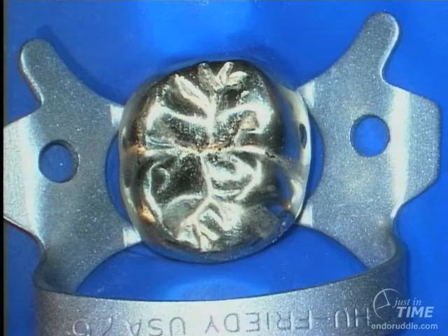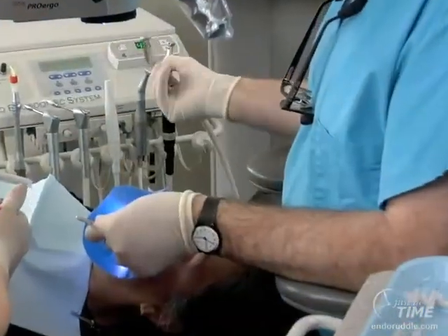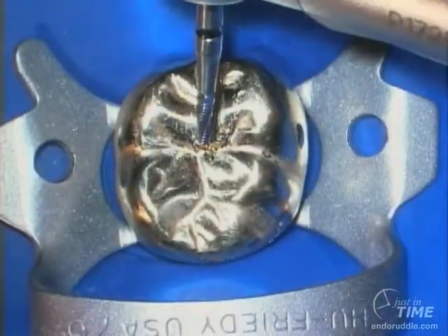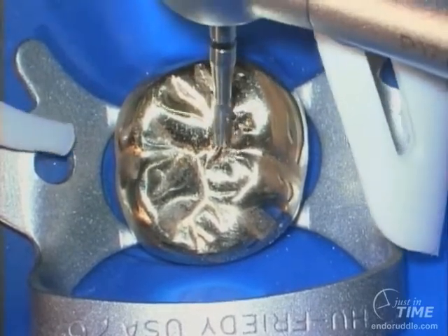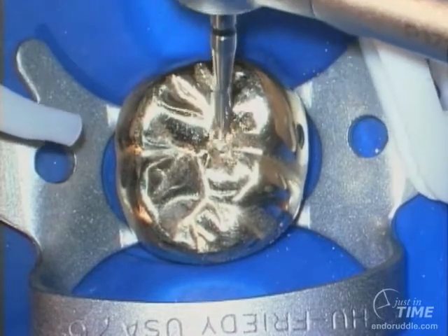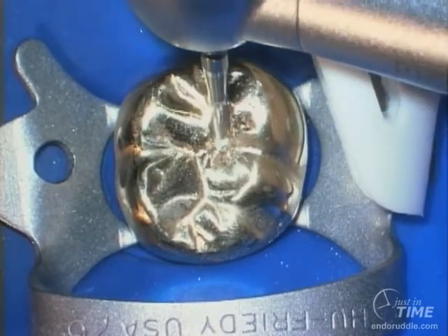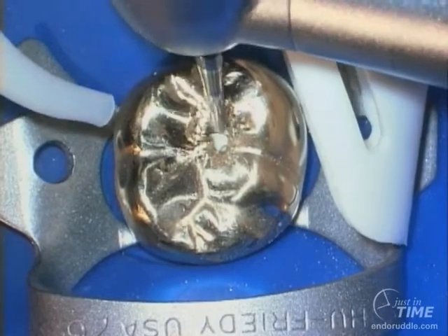Once we have sufficiently isolated the tooth to be treated endodontically, we're ready to begin to envision our access outline pattern. There's an old expression: start with the end in mind. I like to use the transmetal burr — it will reduce a lot of unwanted vibration. Lay the head of the handpiece over on its side to make the burr more of a side-cutting burr rather than an end-cutting burr. It's important to create a little window almost immediately so we can use the side of the burr to begin to remove gold and get access into the underlying dentin.